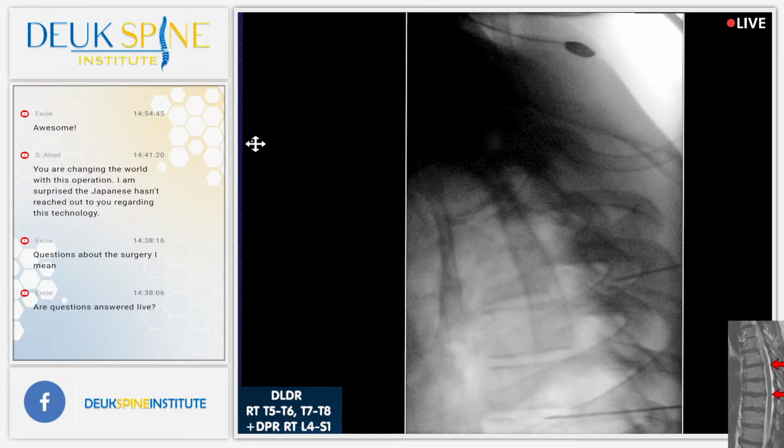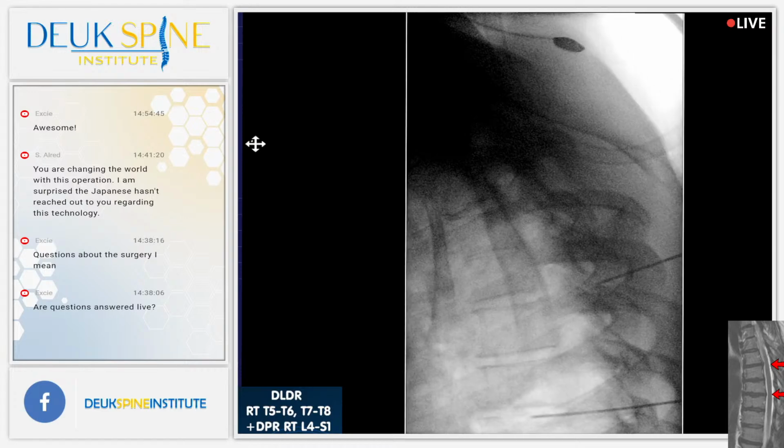She wants to know if you're a guide wire yet. No, we don't want to have a conversation about what we're doing, okay? I just need you to give me certain feedback. You'll be able to watch your surgery later. We're not going to talk you through step by step with you being awake. I need to focus right now on what I'm doing. I need you to relax and give me some feedback if you're having a lot of pain anywhere. Just tell me, okay?